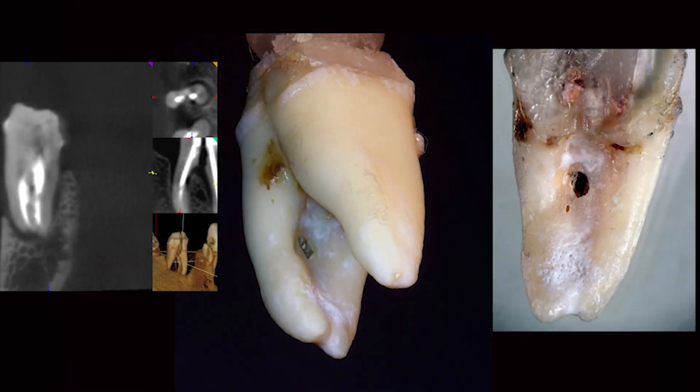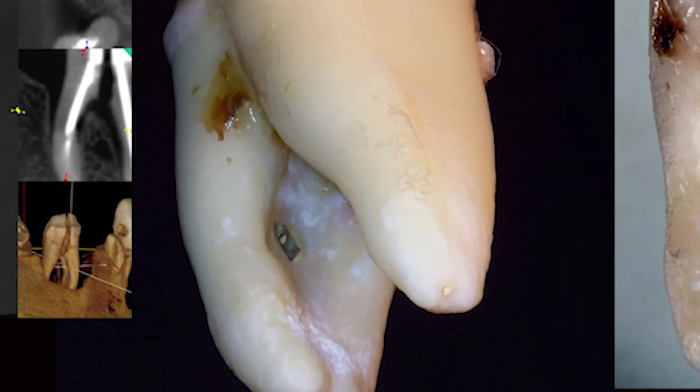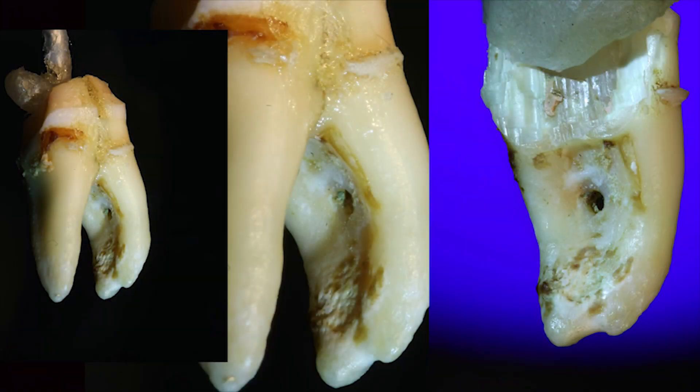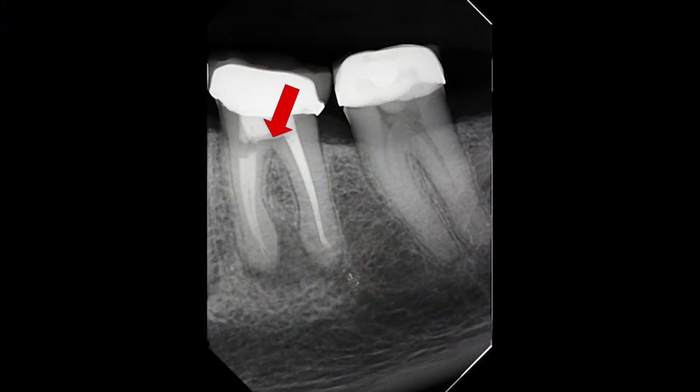Some of the things going through my mind: I want to take the gutta percha out and not enlarge the canals at all, so I don't really want to put any rotary files down in there. I'm worried about a furcal perf here. This was back at a time when we enlarged these canals quite a bit more than we do today. I'm always thinking of these furcal perfs and invaginations of the root — there's a picture I made for Roy Nassari from an extracted tooth he sent me that really illustrates this.